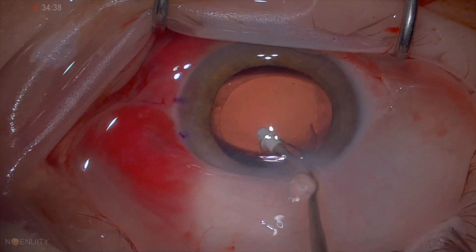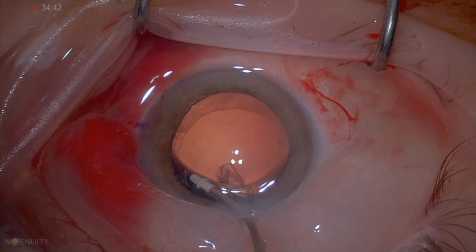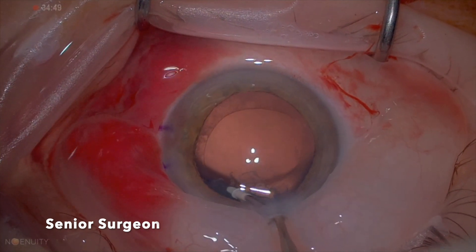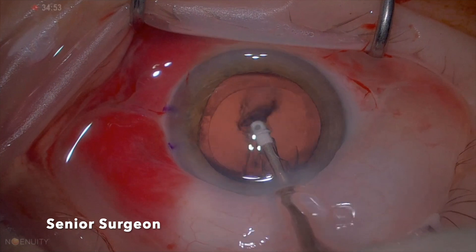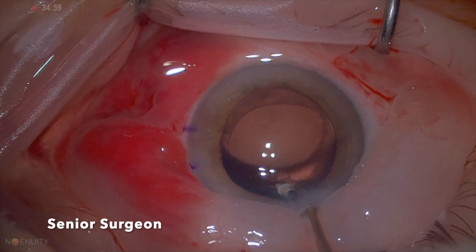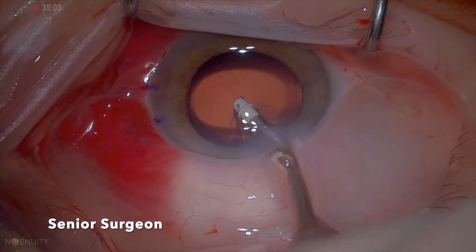Now a senior surgeon takes over and let's see how he would tackle this. First, enough vacuum to engage the cortex. The surgeon is now trying to get the cortex out by tucking under the anterior capsule, enough vacuum to peel off. Once the tip of the IA is facing the cornea and no longer facing downward, then the surgeon would step on the pedal.